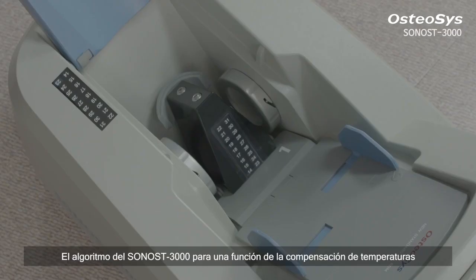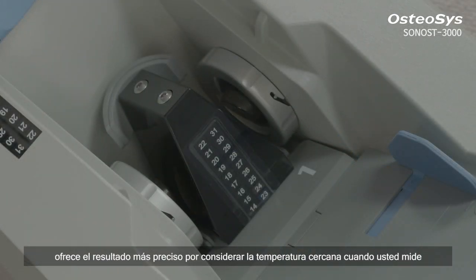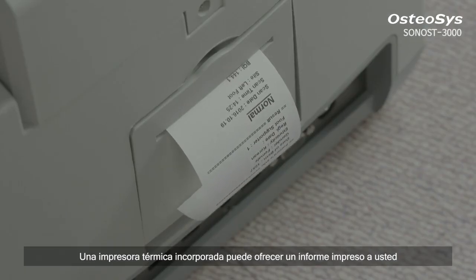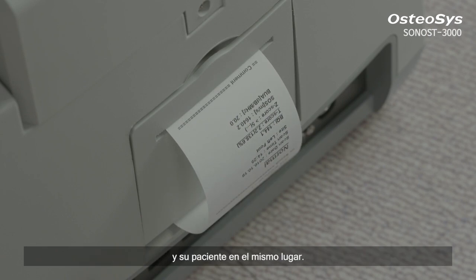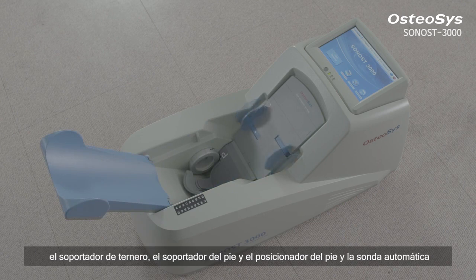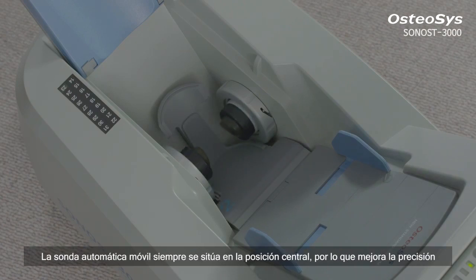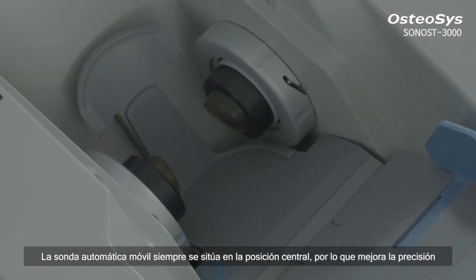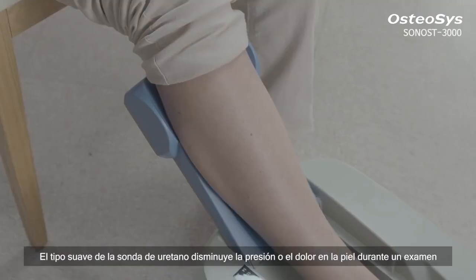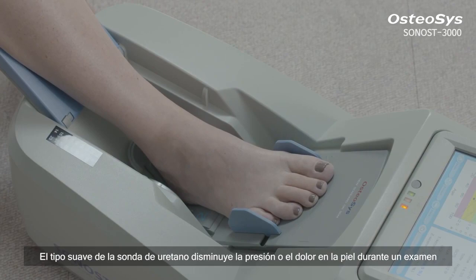Sonos 3000's algorithm for a temperature compensation function offers more precise results by taking the nearby temperature into consideration at the time of the measurement. A built-in thermal printer can give you and your patient a printed report on the spot. Sonos 3000 minimizes possible positioning errors by offering a calf supporter, foot positioner, foot supporter, and automatic moving probe table. The automatic moving probe table also situates itself in the center position to enhance measurement accuracy. The soft urethane probe decreases pressure or pain on the skin during examination.